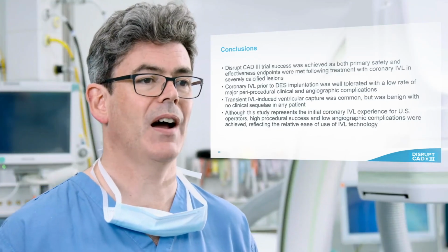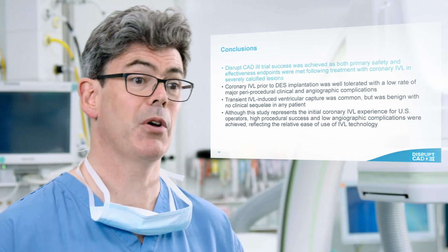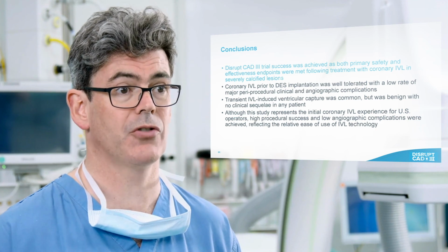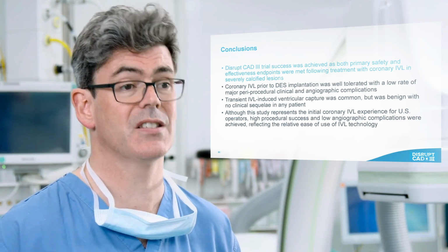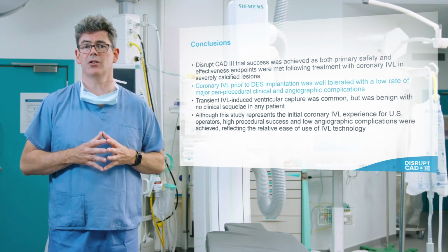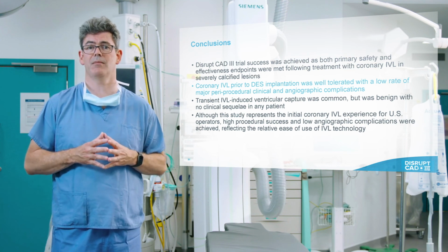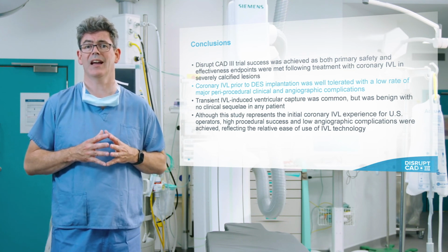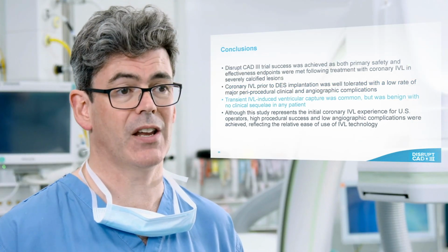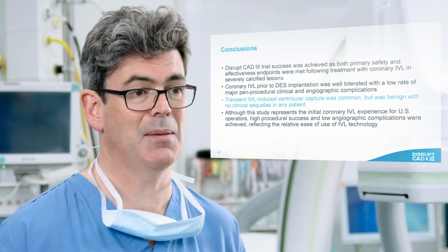In conclusion, I'd say that the success of the DISRUPT CAD3 trial was achieved, as both the primary safety and effectiveness endpoints were met following treatment with coronary IVL in severely calcified lesions. Coronary IVL prior to drug-eluting stent implantation was well tolerated, with low rates of major periprocedural clinical and angiographic complications. Transient IVL-induced ventricular capture was common, but was benign, with no clinical sequelae in any patient.